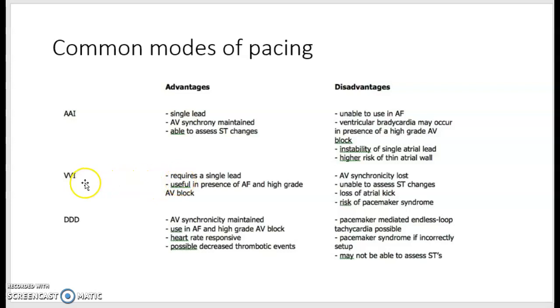And it is a single lead into the right ventricle. That is very important because later, when we go into low power heart failure devices, we will put in a left ventricular lead. But in this lesson, we are only dealing with the right ventricle.